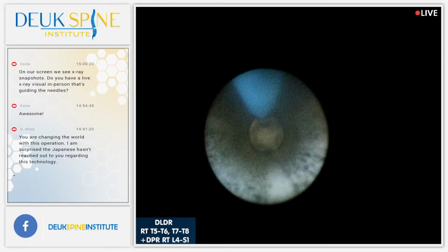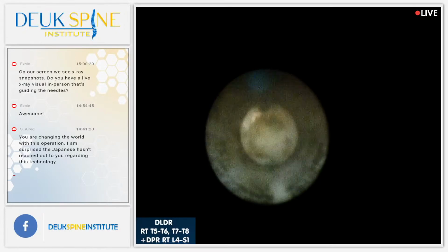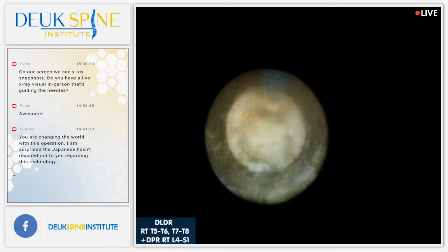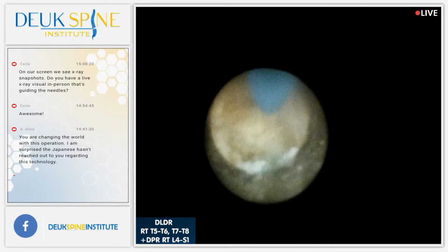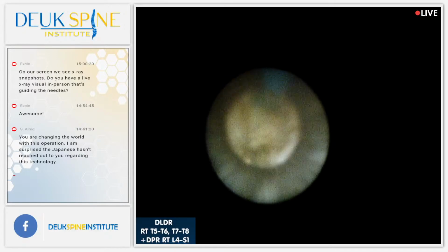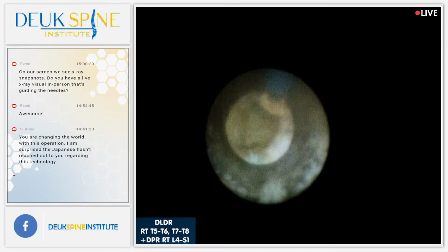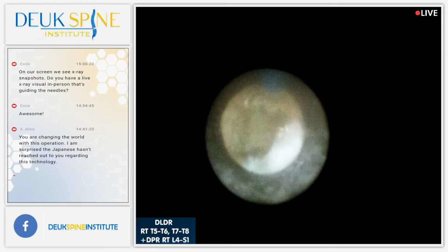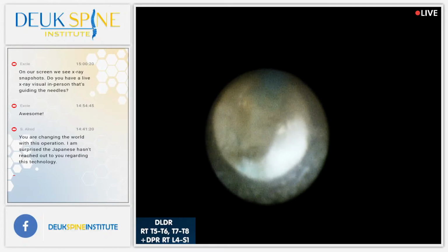I could do it, but it would be exposing the patient to unnecessary radiation. We do have a cine mode on this fluoro, which allows us to hold the button down and keep continuously taking pictures, but the amount of radiation released is massive compared to a still shot. Remember, one of my goals during surgery is to get the information I need, but not overexpose the patient, my staff in the operating room, or myself to unnecessary radiation risk. So taking stills is much better than continuous video shots, which are unnecessary. You just need snapshots as waypoints.